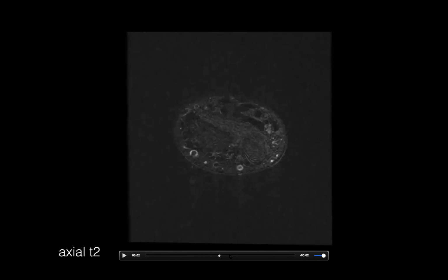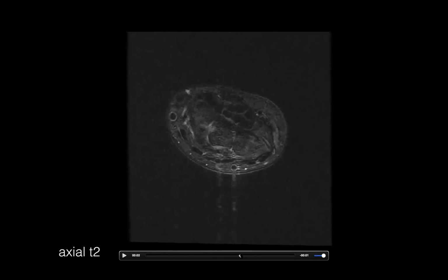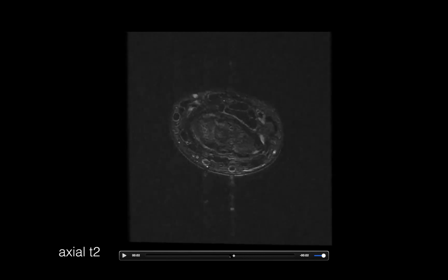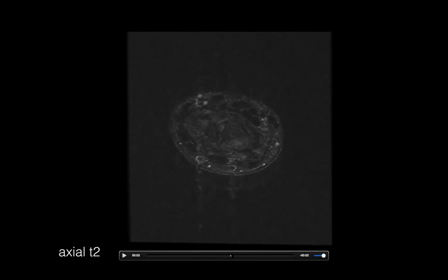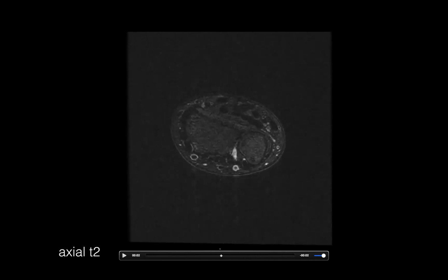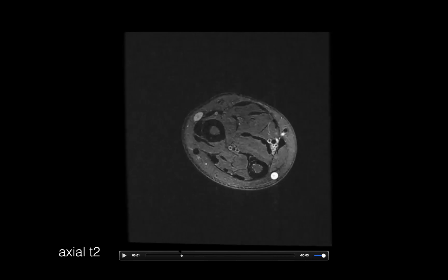And then also you'll notice here, this is not like single shots where you get an image and you get the whole of K-space, then move on to the next one. Here you get some phase encodes and then move on and get others. And this is done in a couple of banks. So that's why the arm seems to be bouncing right through these banks. There was patient motion in between banks of images that were acquired.